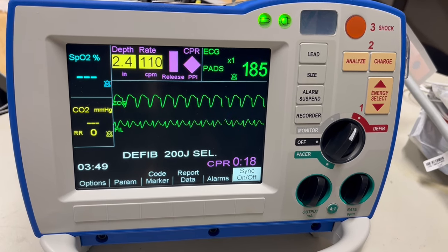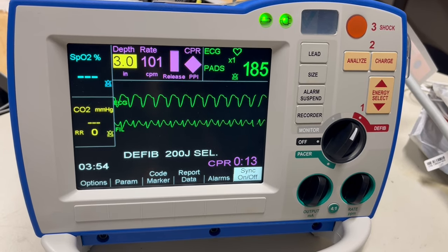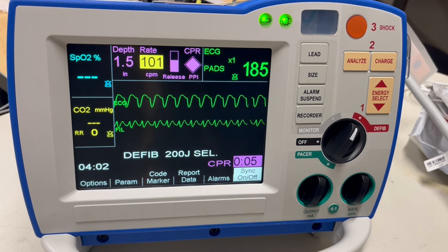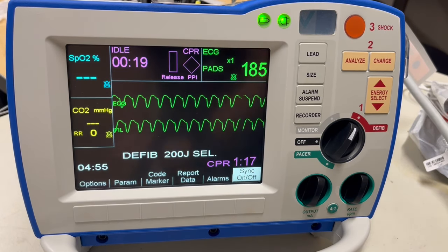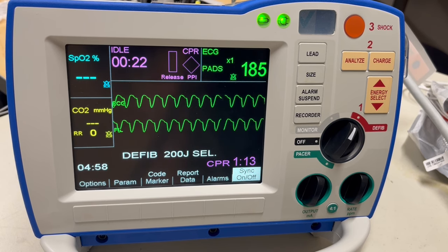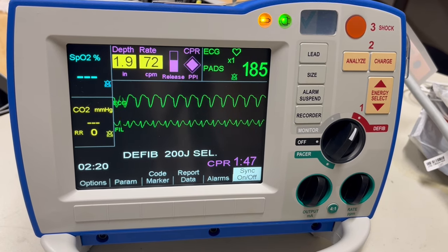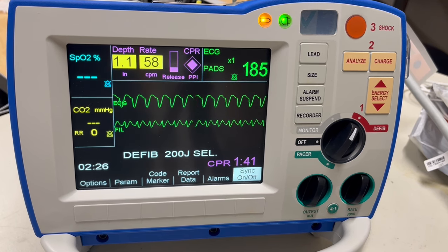Lastly you will see CPR PPI, which stands for Performance Perfusion Indicator. This is displayed by a diamond-shaped symbol on the CPR dashboard to show how well your compressions are being performed — your goal is to have the entire diamond be solid purple. When you stop CPR for a pulse check, it will show you how long you've been idle; remember we're only supposed to stop CPR for 10 seconds. Anything highlighted in yellow is prompting you to adjust your compressions. This device needs to be right in front of whoever is performing CPR so they can get immediate feedback on the quality of their compressions.